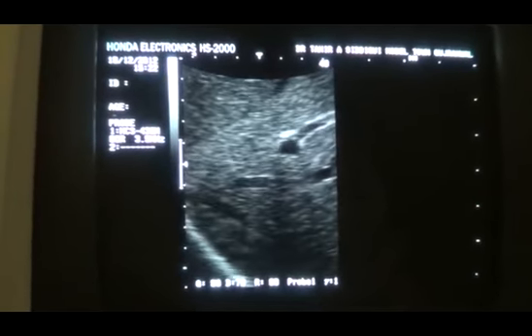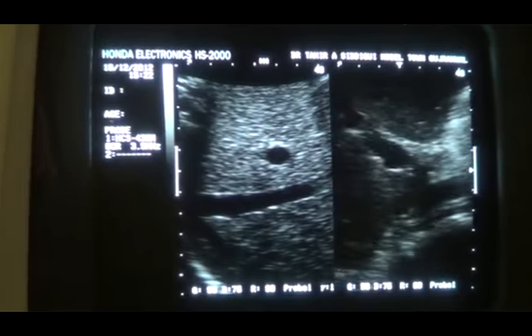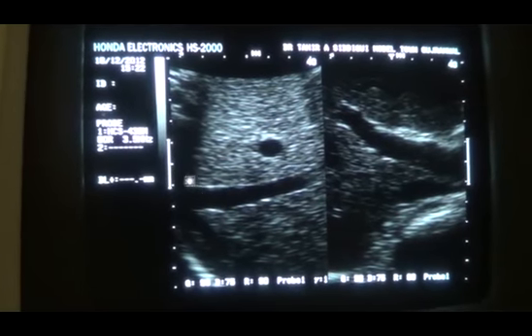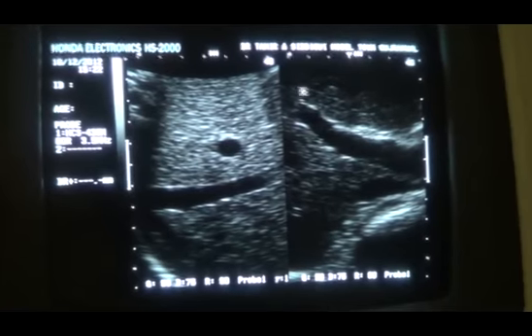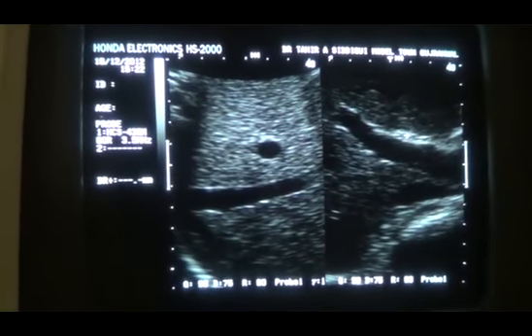This is the hepatic vein with no echogenic border around it, and this is the portal vein with echogenic borders around it. See the vessel, no echogenic border. This is the hepatic vein. This is the portal vein because it has an echogenic border around its anterior wall, and these are called the periportal echoes.